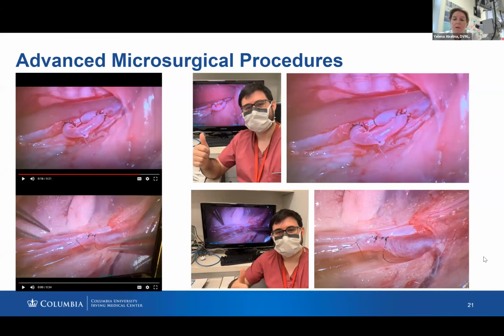If we are not sure and the vessel is not patent, we cauterize it, cut it, open the lumen and look inside. We use that until we figure out why the vessel is not patent. So the surgeons actually learn what they've done wrong, so they prevent that.